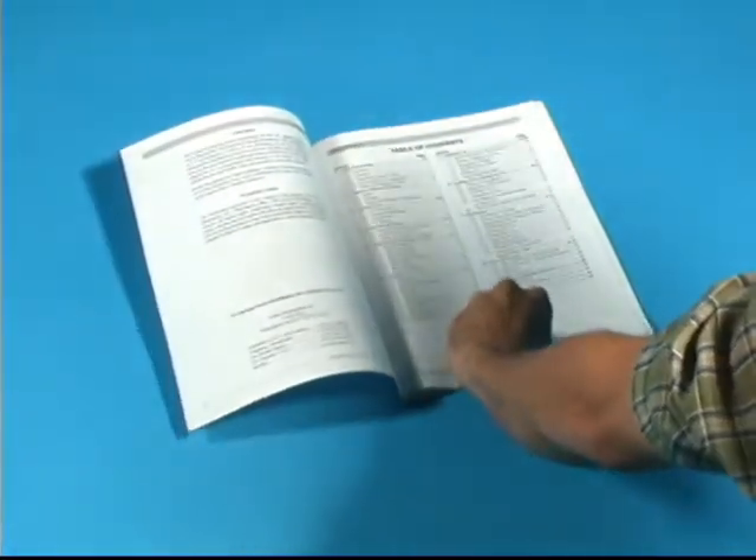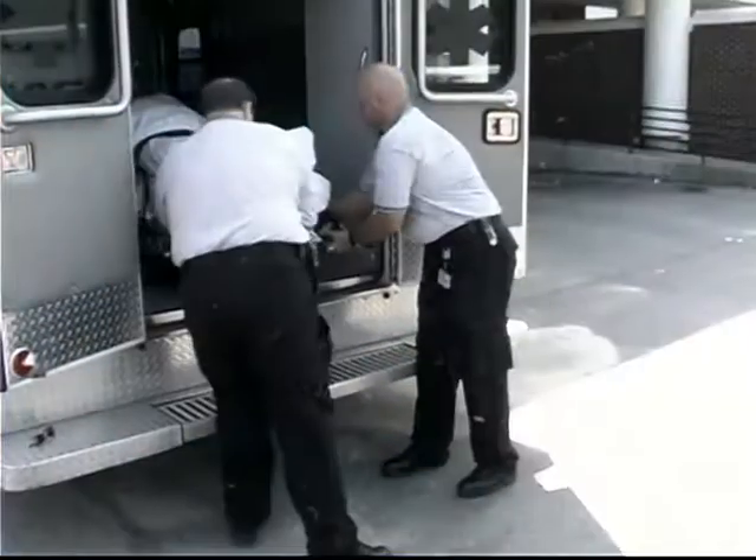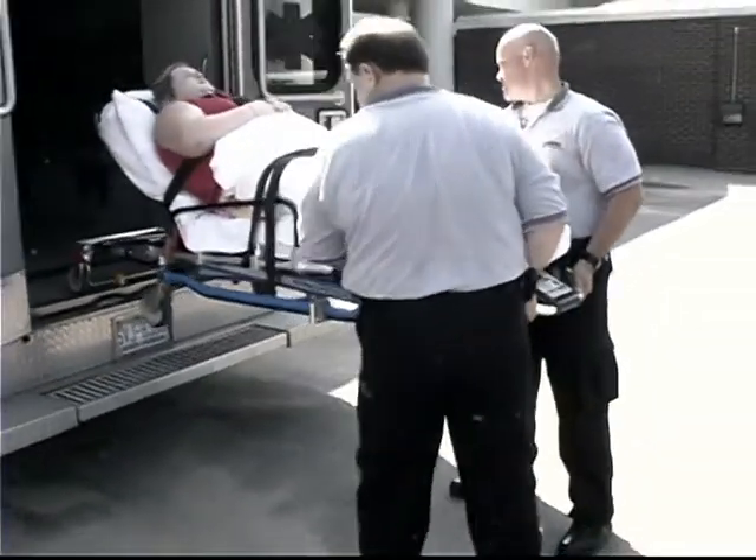Also, refer to the manual for guidelines on the proper care and maintenance of your PowerFlex. Before placing the cot in service, be certain all personnel who will work with the cot are trained.